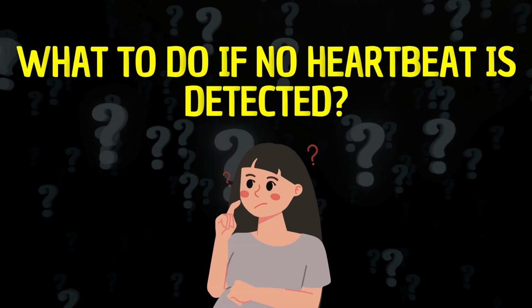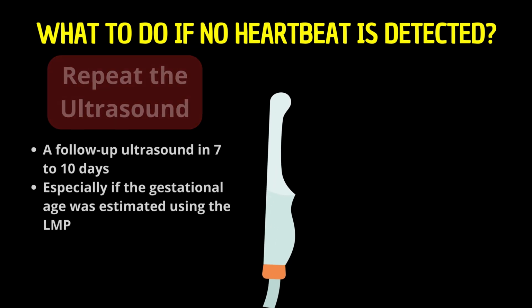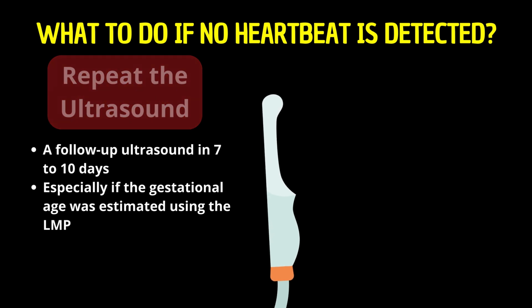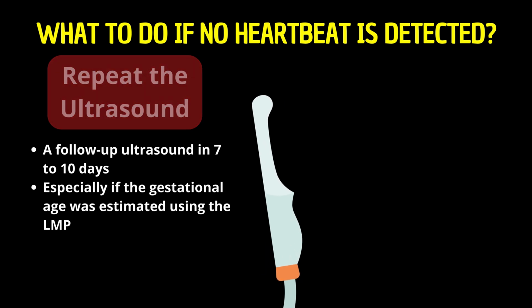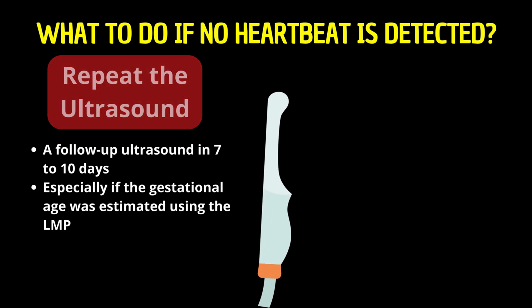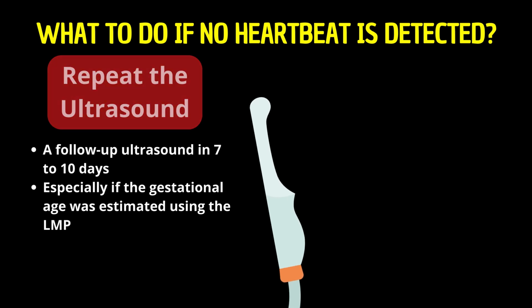What to do if no heartbeat is detected? First and most important, repeat the ultrasound. A follow-up ultrasound in 7 to 10 days is crucial to confirm the initial findings, especially if the gestational age was estimated using the LMP, which can sometimes be inaccurate.